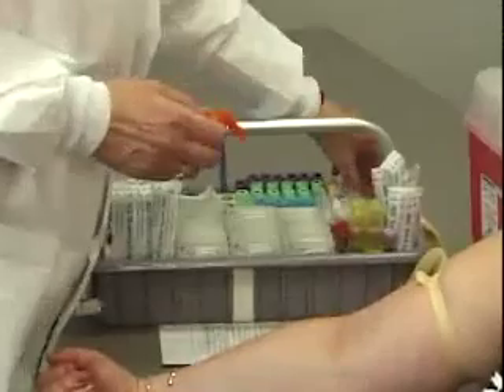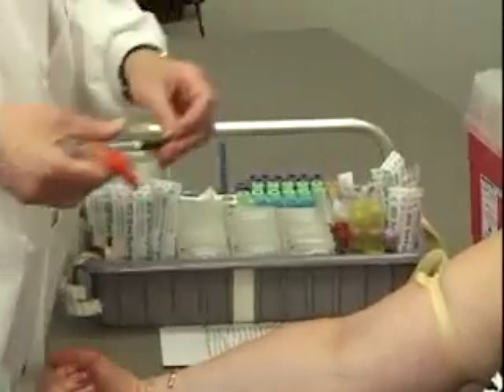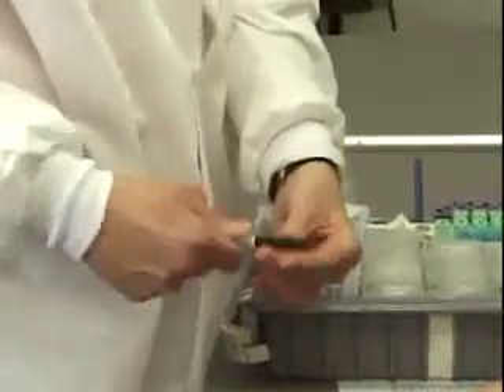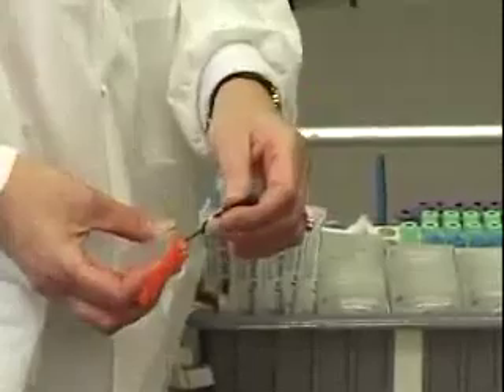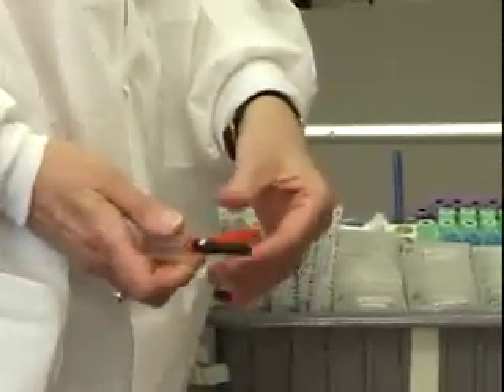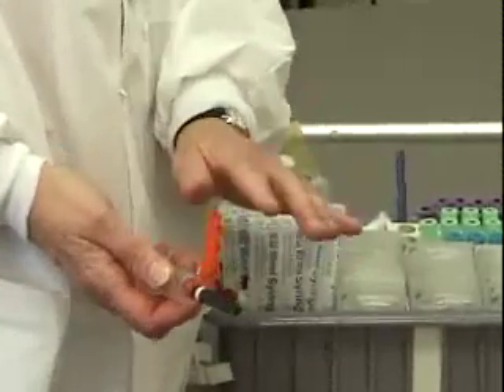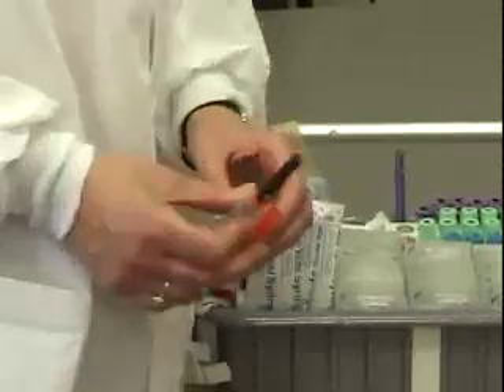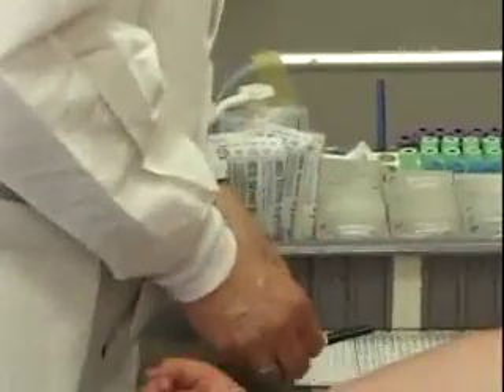I'm going to use a 21 gauge needle, which comes in a black sheath, and I'm going to make sure that I break the seal. This screws into the barrel. This is a safety holder — it's not going to do anything until the end of the procedure, where we're going to snap it over the needle as a safety device for the phlebotomist.